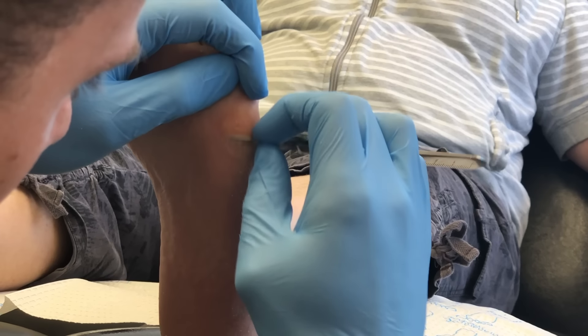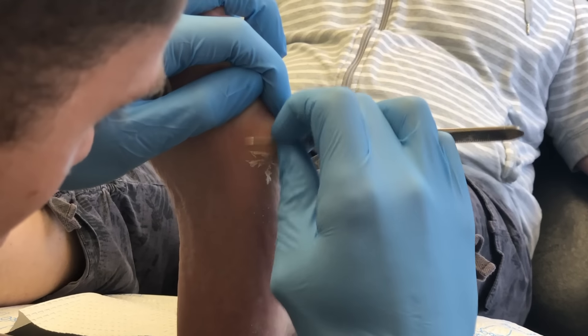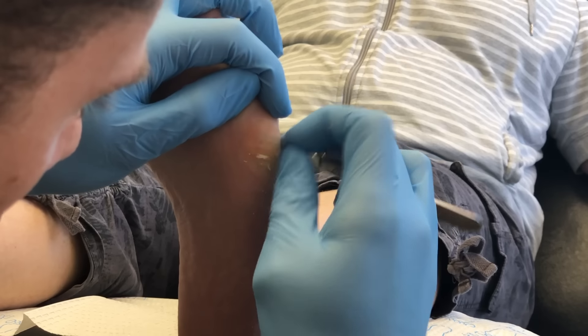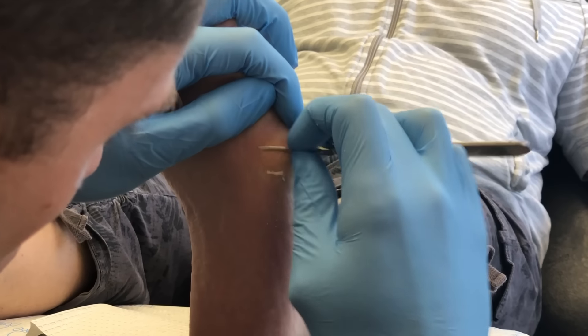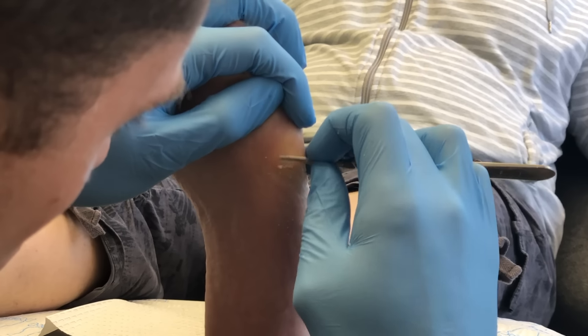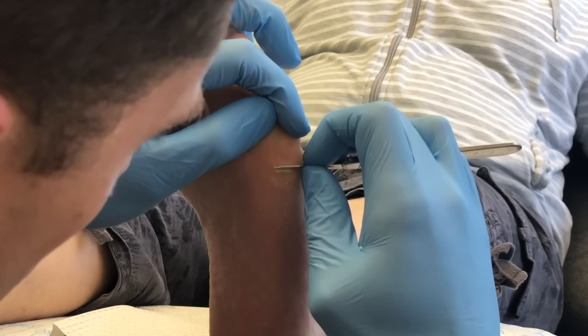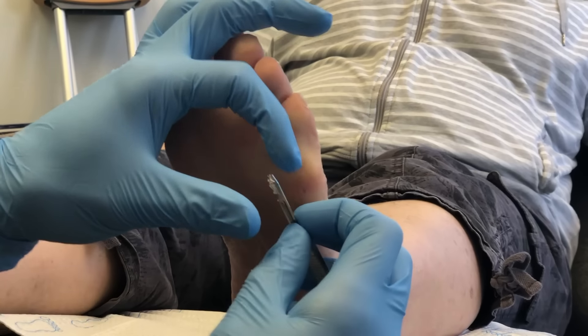I'm pointing to the heloma. I've switched to a 15 blade to get more fine detail. We're taking down the tissue and making it flush with the surrounding tissue, and then making that heloma a little bit more noticeable in the center.